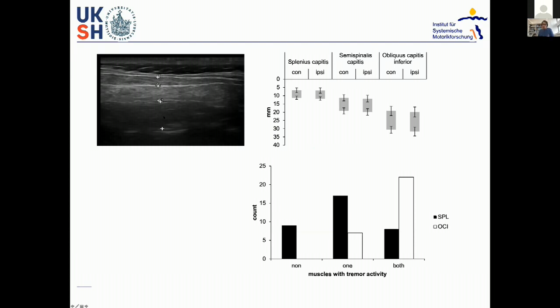But for someone who is a beginner in this topic, I think it's very helpful that there is someone who shows this really in real life with a subject and an ultrasound machine. This is really hard to show just by a presentation, because it's a lot about eye and hand coordination and finding landmarks, how to orientate.